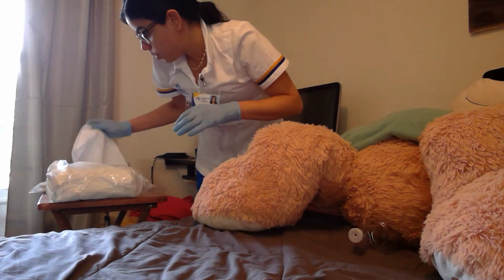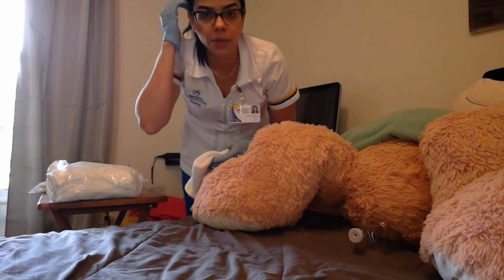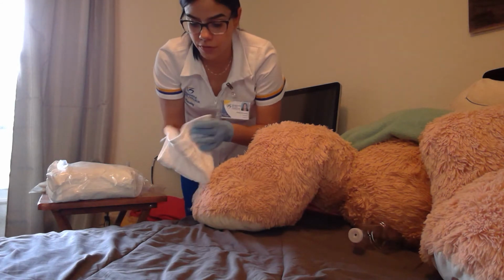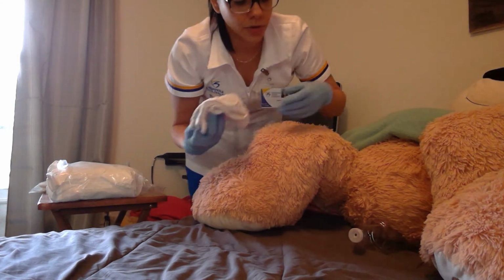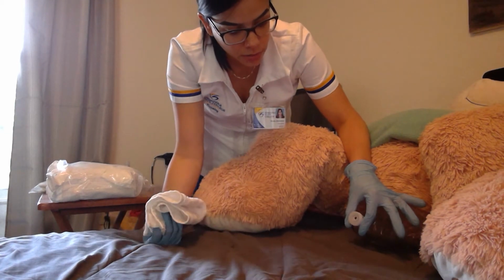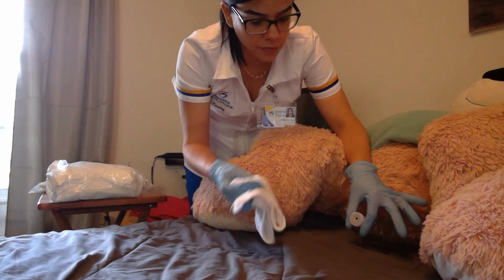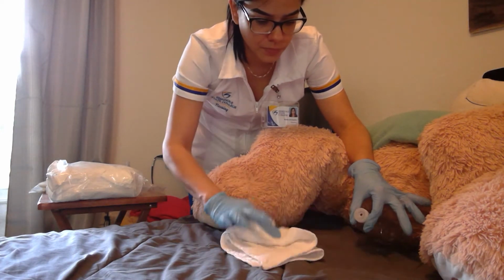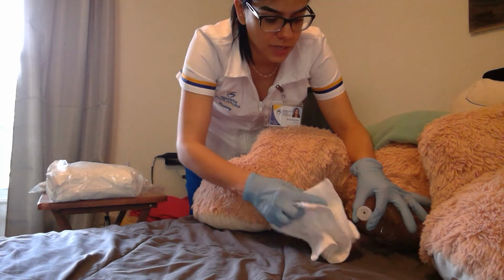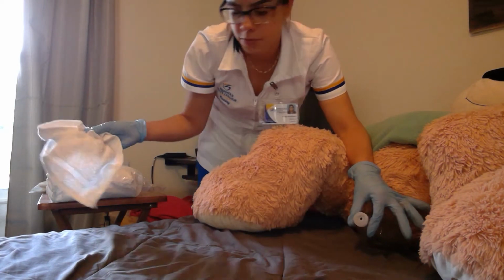And for that, it all depends on your institution. Some institutions might require you to use a special wipe. Some others will be okay with washcloths and water. So for this video, that's what we're gonna do. We're gonna separate her labia, and we're gonna locate her urethral meatus, and then we are gonna do some cleaning from top to bottom on one side. Top to bottom, we're going to use another part of our washcloth on the other side, and then top to bottom in the center, and we're going to dispose of this.